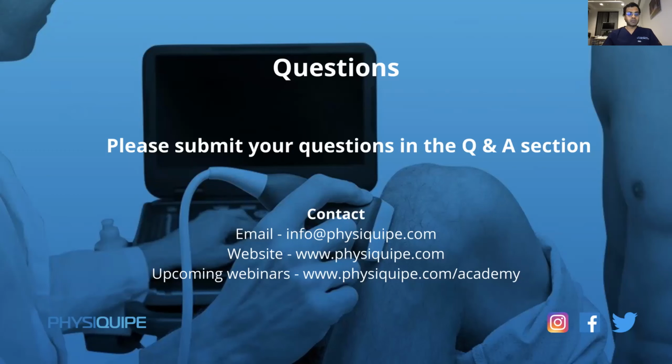To be honest with you, my go-to usually is an MRI scan, but I always like doing an ultrasound scan as well. The reason being, with ultrasound, it's a dynamic test. I can access all of those structures. I can talk to the player or to a patient to see where their symptoms are. I can try various things like increasing the intra-abdominal pressure with Valsalva maneuvers to see if I can tease out any hernias, and try different positions and movements where the patient can replicate their symptoms.